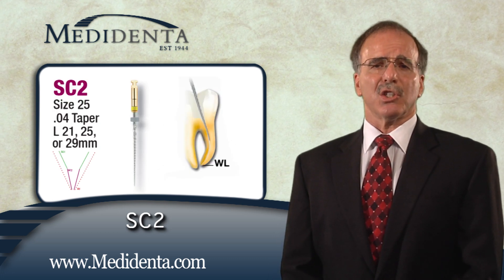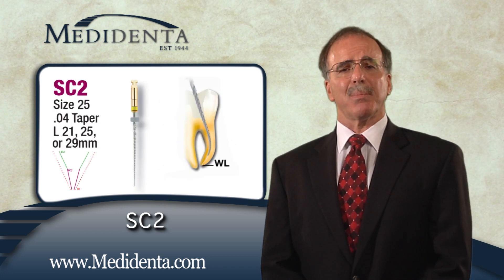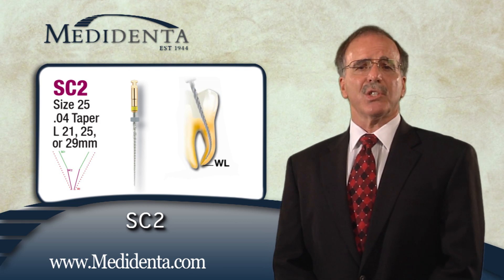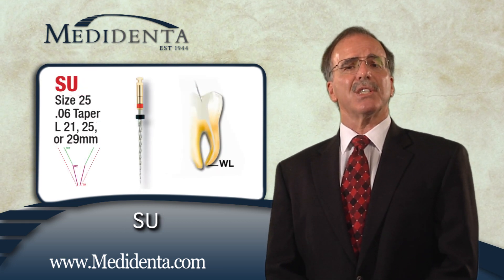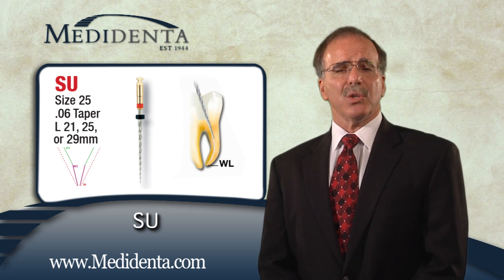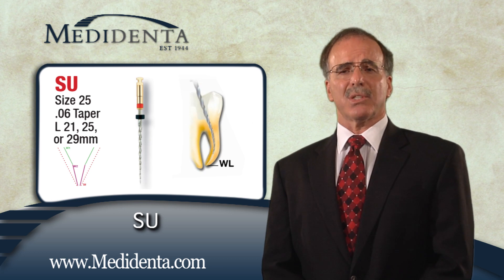The SC2 instrument is 25 at the tip at an 04 taper and is easily taken to the full working length. The SU instrument follows the action of the SC1 and SC2 instruments to smooth out the root canal walls. The SU is 25 at the tip at an 06 taper.